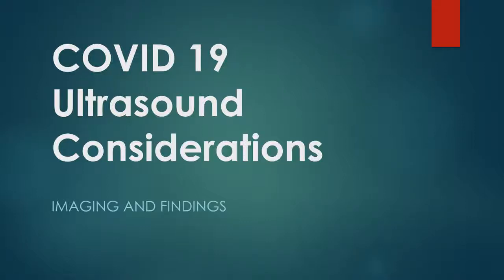Hello. Many imaging modalities are utilized to evaluate patients with suspected COVID-19, and we will be talking about lung ultrasound. We will be talking about imaging and findings, and I will be demonstrating through the use of a BodyWorks Eve simulator. I'm John Shields. I'm a nurse anesthetist and faculty at Middle Tennessee School of Anesthesia. As well, I'm on staff at Vanderbilt University Medical Center.